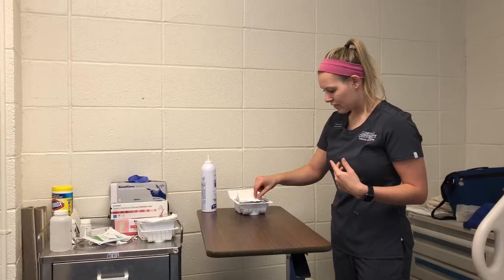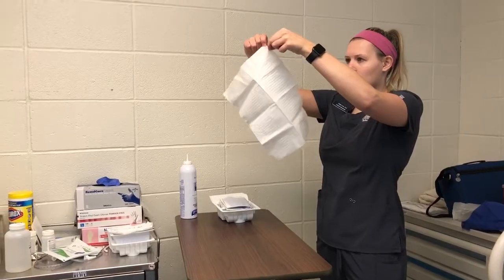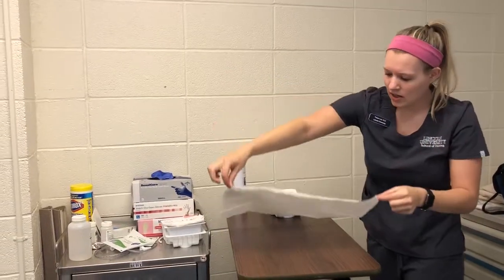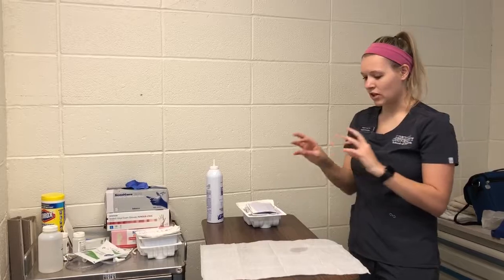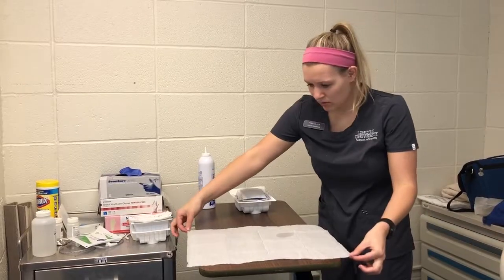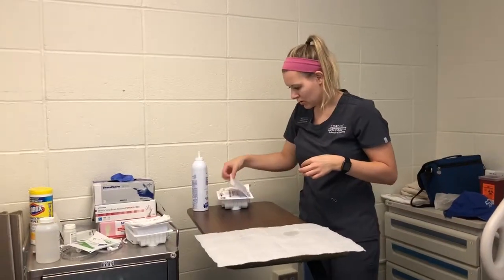And right here I have this drape that has a 1-inch border of being non-sterile. And what this is good for is extending your sterile field so that you can move things in your sterile kit onto this sterile area and just give yourself some more room. So we'll move this over a little bit. We're going to put on our sterile gloves now.